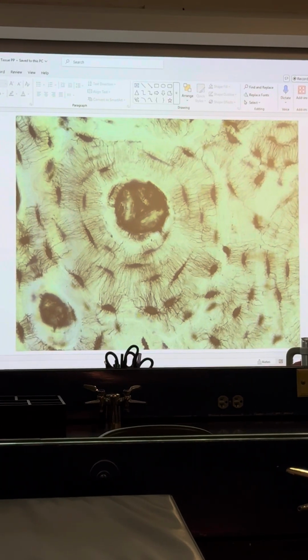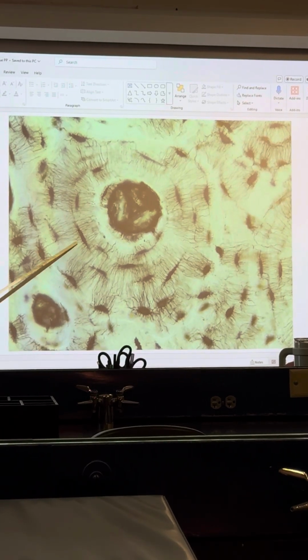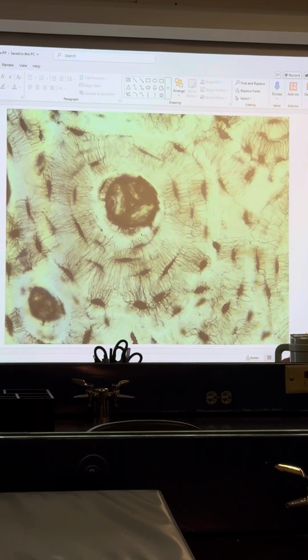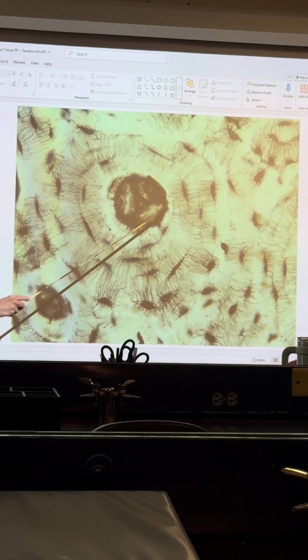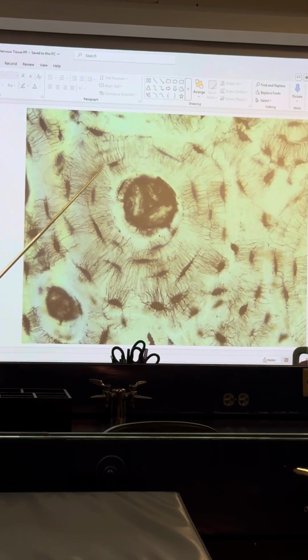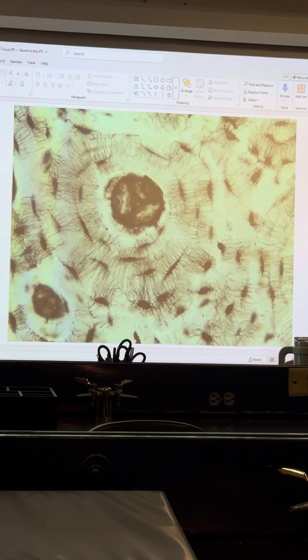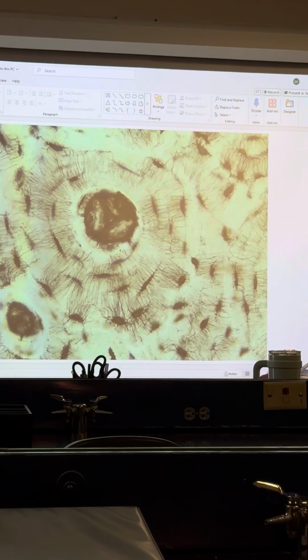True or false? Cartilage also has blood vessels. Is that true? False. No blood vessels in the cartilage. What are the holes called? Those are, again, just like in cartilage, called lacunae, or lacuna for one. But we don't have chondrocytes in bone, we have osteocytes, right? Did he ask you for the little black things? Yeah, the canaliculi. And then I don't know if he's asking you for the rings, but yeah, the rings.